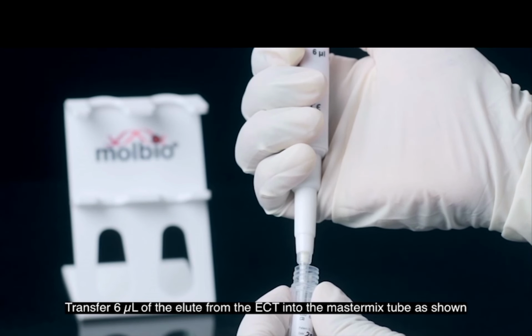And only 6 microliter. As you saw, the 100 to 150 microliter of elute we have, but for each test we need only 6 microliter. So for the MTB test, you will be doing that 6 microliter. If it is positive, you will be doing the RIF test. There is also 6 microliter. There may be some troubleshooting where you may have to repeat the test. For that also, we have enough sample left.